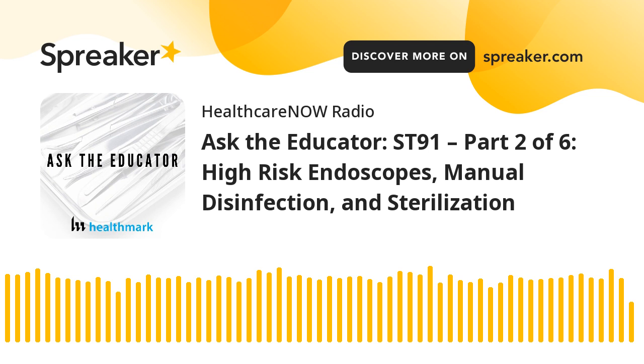You have any type of endoscope that was or is more frequently associated with outbreaks of infection or cross-contamination based on the reports that came in or the citations for infections and cross-contamination, and also those that generally have a higher risk associated with them.